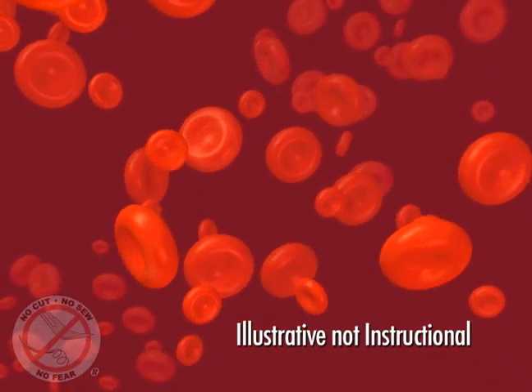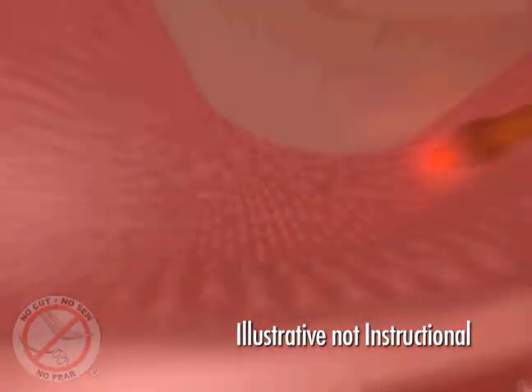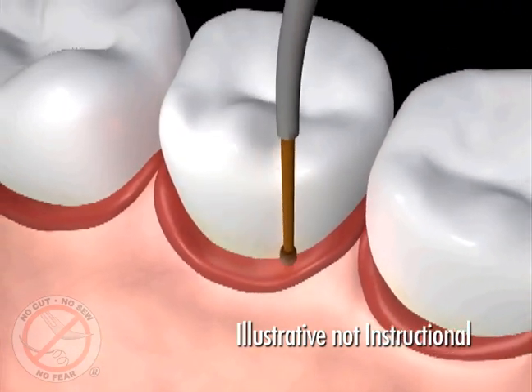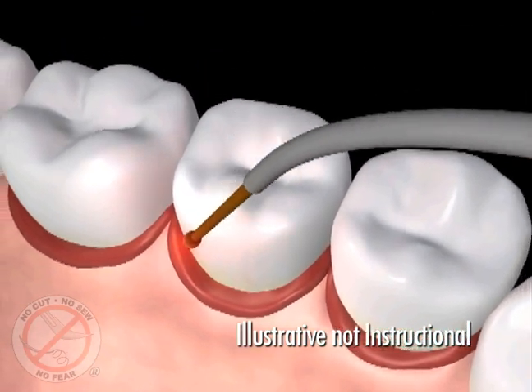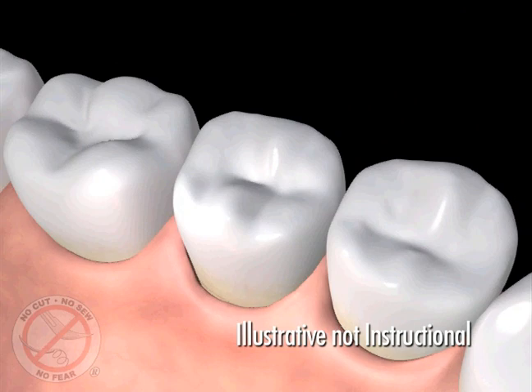This also causes the blood to become sticky, creating a seal around the teeth. Once the seal is formed, we have created a clean, closed, and stable environment for healing to begin. We have tipped the scales in favor of regeneration versus degeneration.